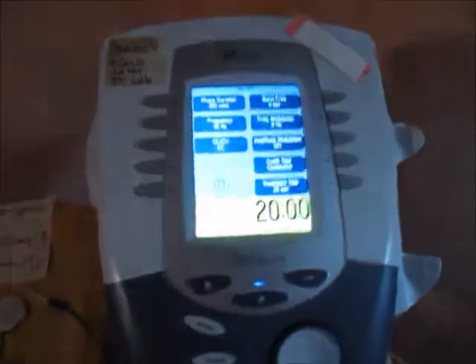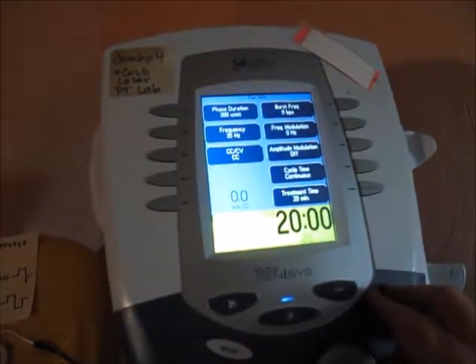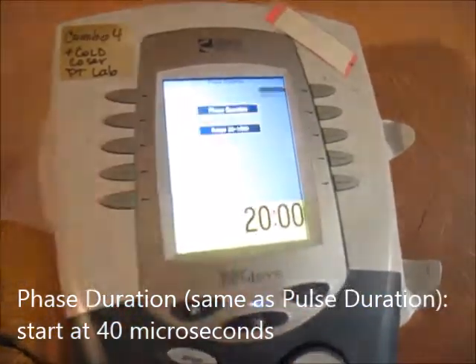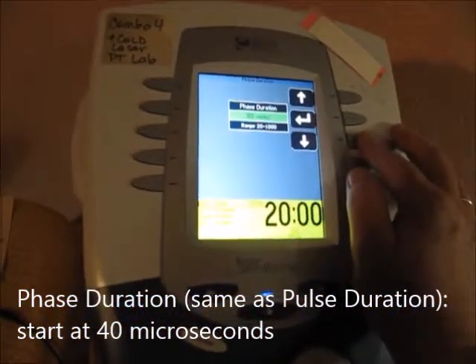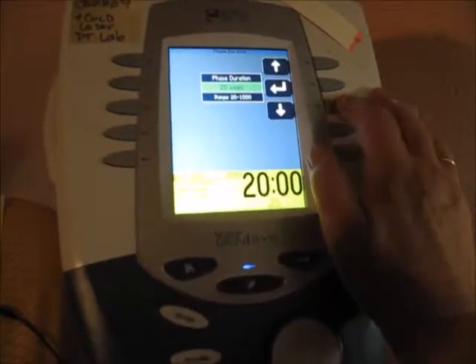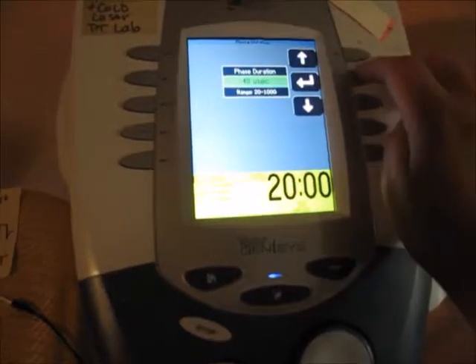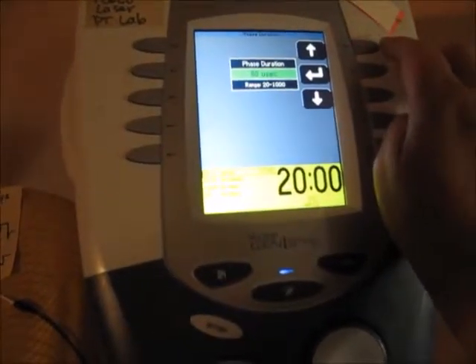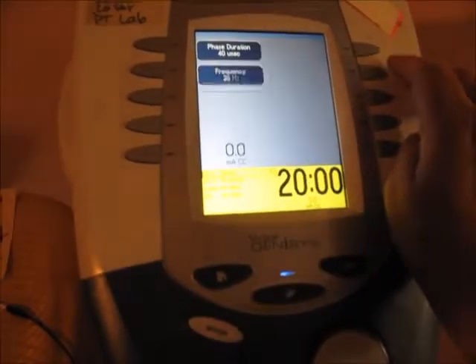Coming over to the screen — the phase duration shown is far too long, so you need to go really low on this one. Phase duration is the same as pulse duration and pulse width. Set a starting point of 40 microseconds and please don't go above 80 microseconds. We will set it at 40 to begin.